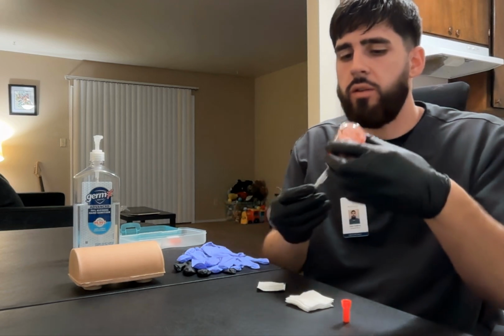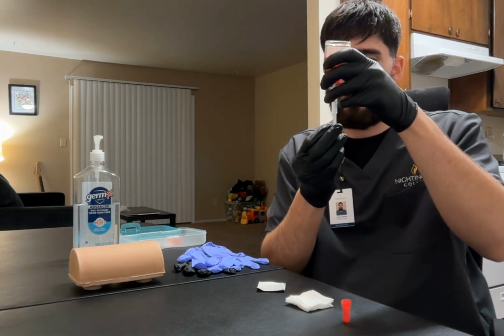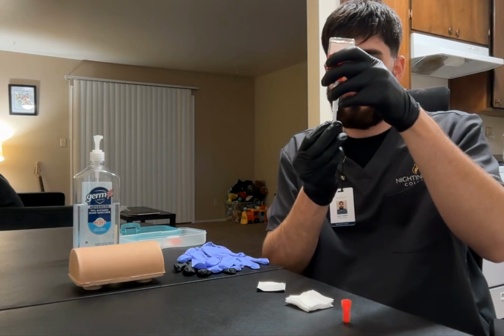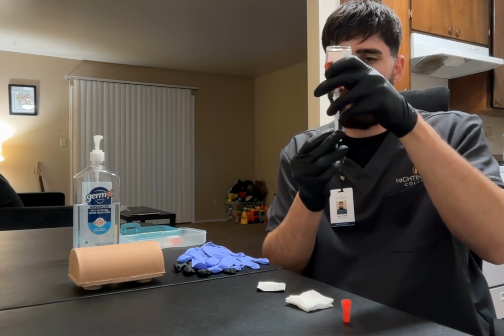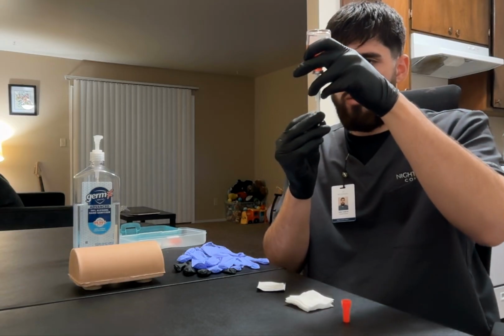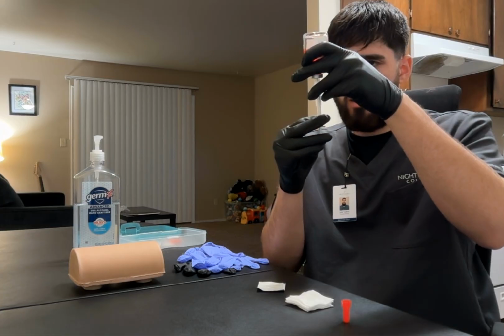I'm going to flip the vial over and withdraw 0.1 ml of the medication to be administered, which is at the dose of 5 TU per 0.1 ml. I'm going to remove any air bubbles from my medication.